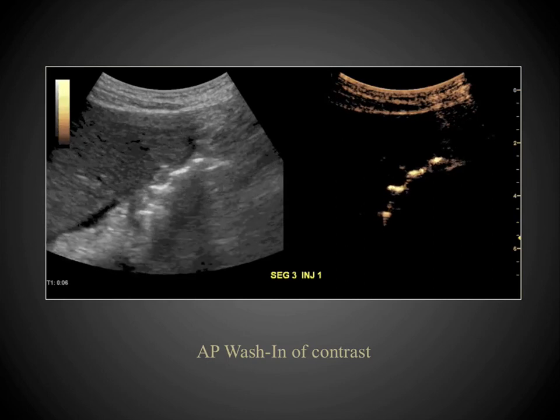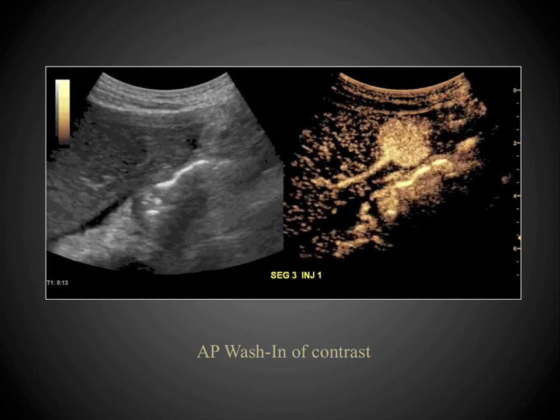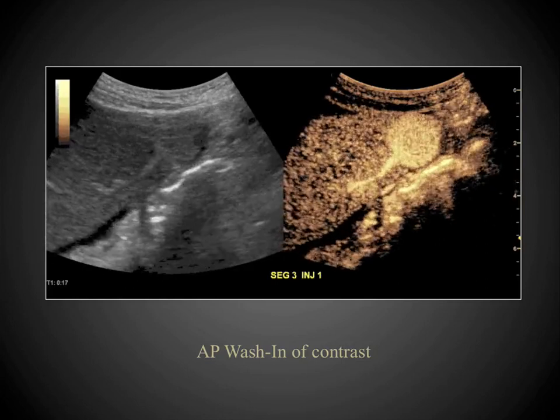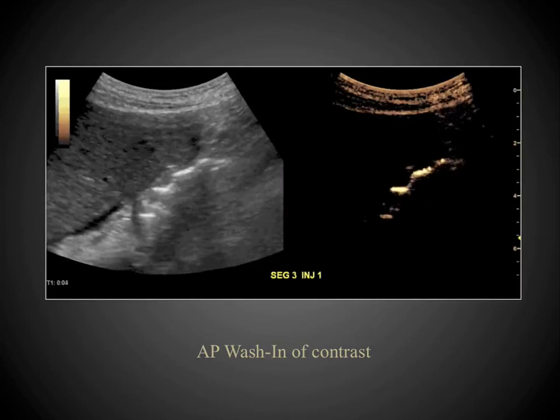Real-time scanning of this nodule shows arterial hypervascularity. Video recording of the wash-in of contrast is performed from visualization of the first bubble in the field of view to peak arterial enhancement for documentation. Subsequently, intermittent scanning is performed every 30 seconds to assess for washout.